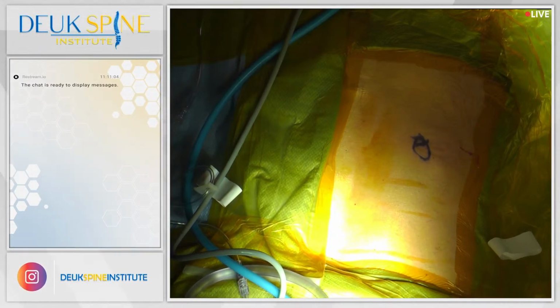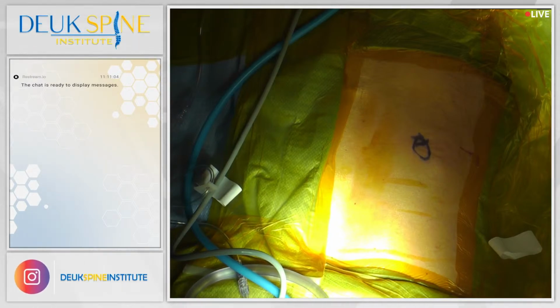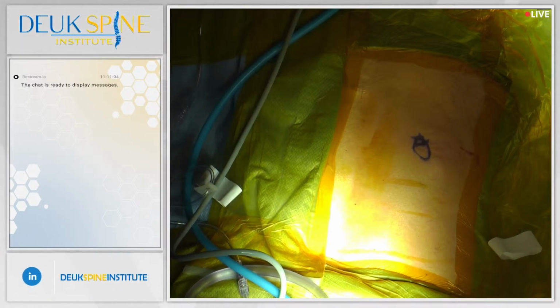He's been suffering in pain for over a year and found Deuk Spine Institute online. We did an MRI review. I found that his pain was mostly coming from the L4-5 disc on the left. Based on that diagnosis, we recommended the Deuk laser disc repair. He's here now.